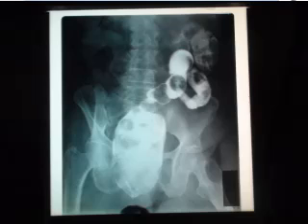It's not globular outpouches like diverticular disease, it's a filling defect. The polyp is a filling defect, but diverticular disease is like globular outpouches from the mucosa.